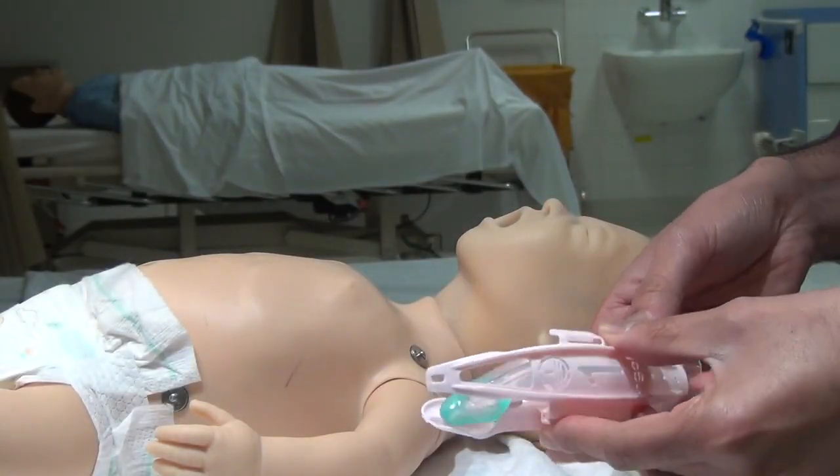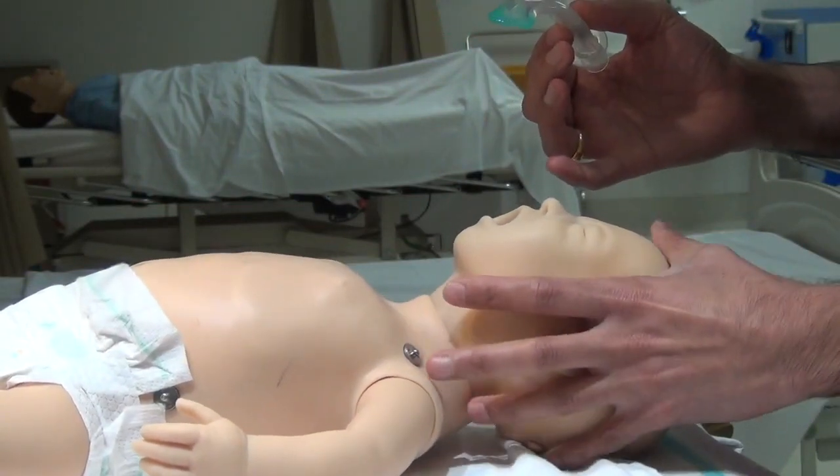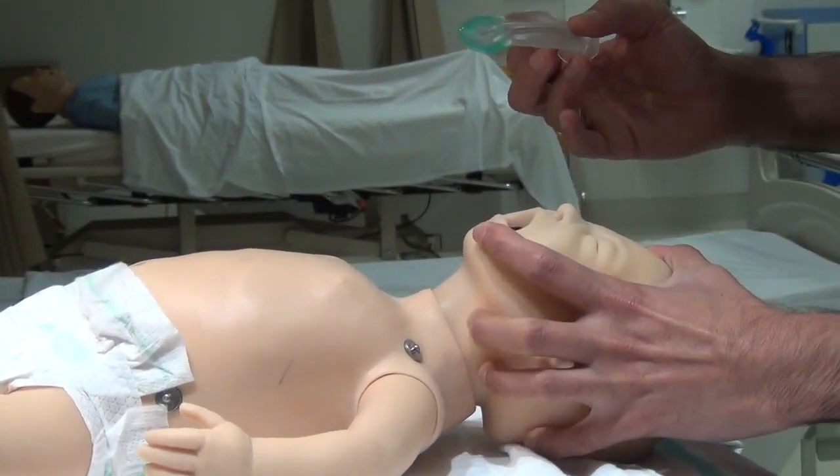Take the iGel out of the plastic enclosure. With the baby's head in the sniffing position, gently open the baby's mouth.